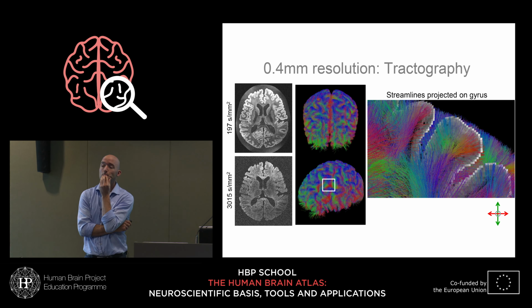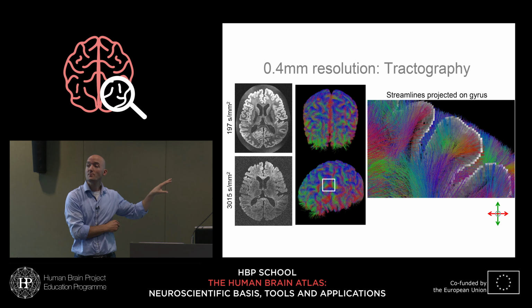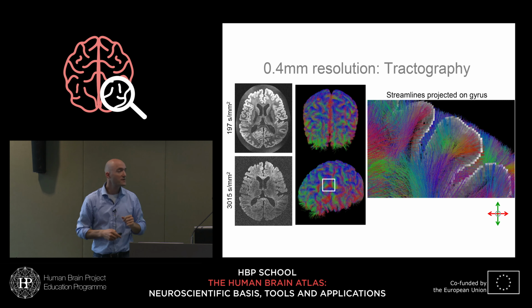So why don't you trust these data-driven methods like the ensemble average propagator? No, I don't here today have any modeling preferences. I have an interest here in generating ex vivo diffusion data that is suitable for all of those, right? So we do ball and stick, we do CSD, constrained spherical deconvolution, or propagators. And in fact, what you need for some of those is multi-shell data, multiple b-values. Yes, and I'm about to get there.